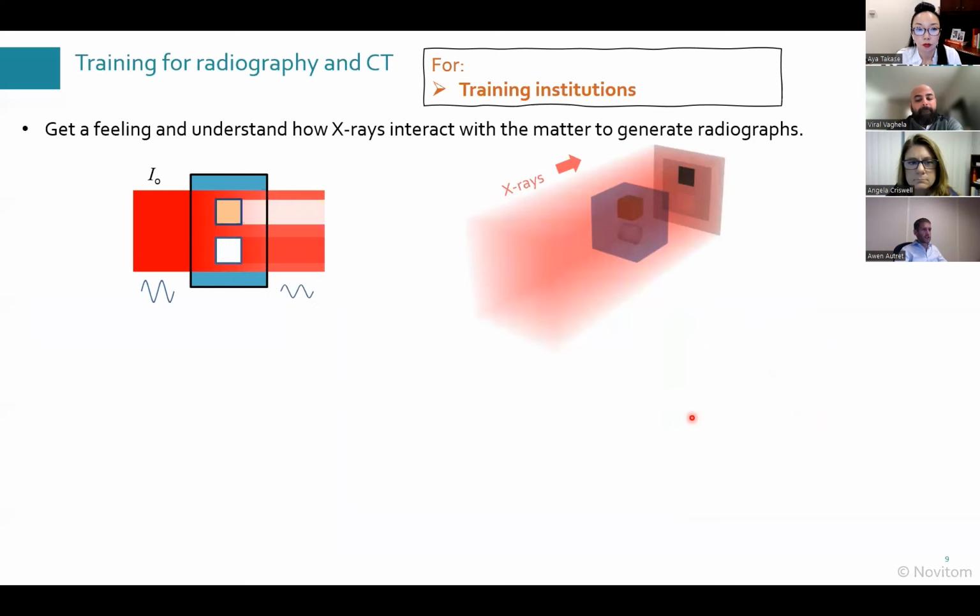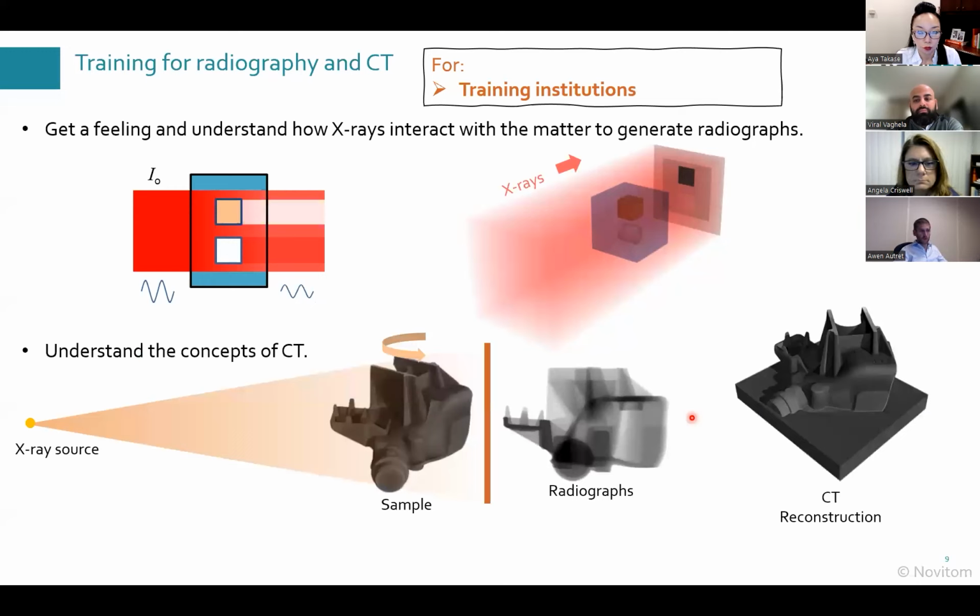And another application is to train people to the X-rays and the CT techniques. So you can do practical works with the software, where you give to the students an access to the software, so they can play with the different parameters and better understand how the radiographs form. And then you can go to the next step and explain how CT works, or the acquisition of all the radiographs, and how the reconstruction also works.